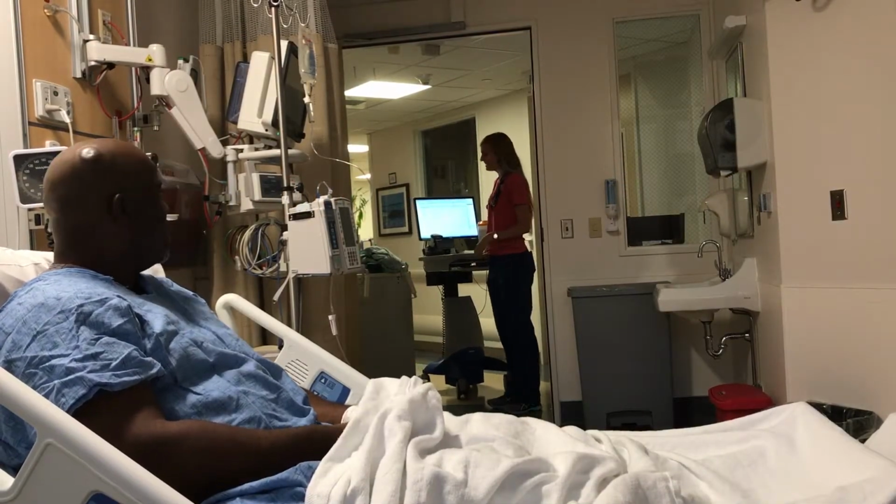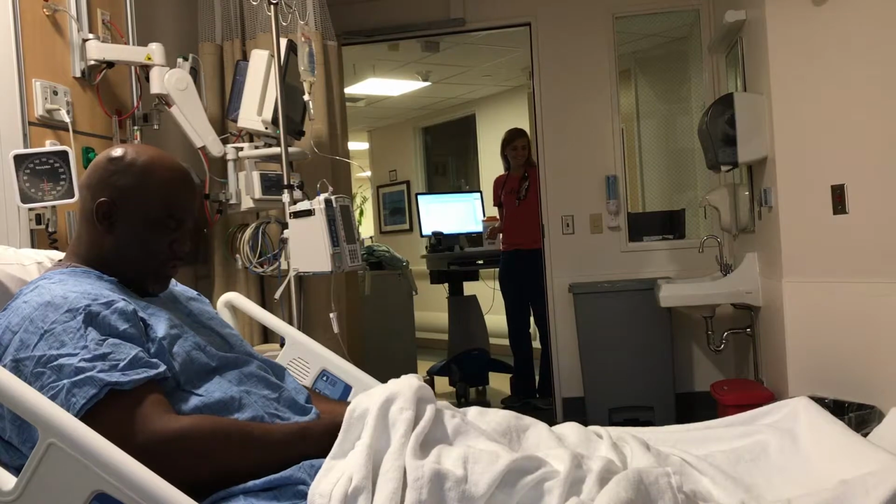Hey, Mr. Holiday. I've got some meds for you. Alright, Margaret.